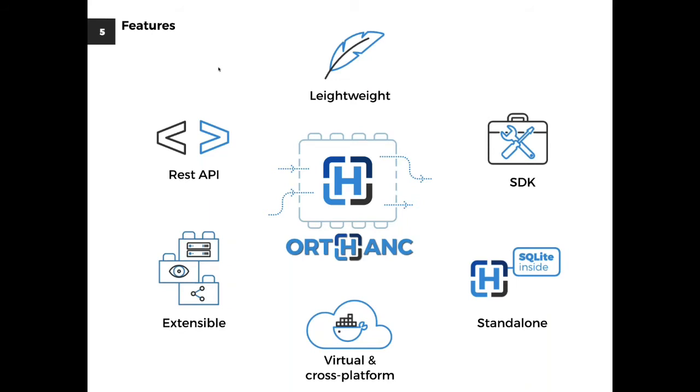It has a REST API on all the features that run in Orthanc, so you can basically drive Orthanc through any other application. It is very extensible in the sense that it can have plugins. So the core of Orthanc is GPL, and then it has AGPL plugins that can serve for a specific type of storage, but also viewers. And one of the viewer plugins is the Cornerstone implementation within Orthanc. And then there are some other plugins that I'll talk about later, one of them at least.